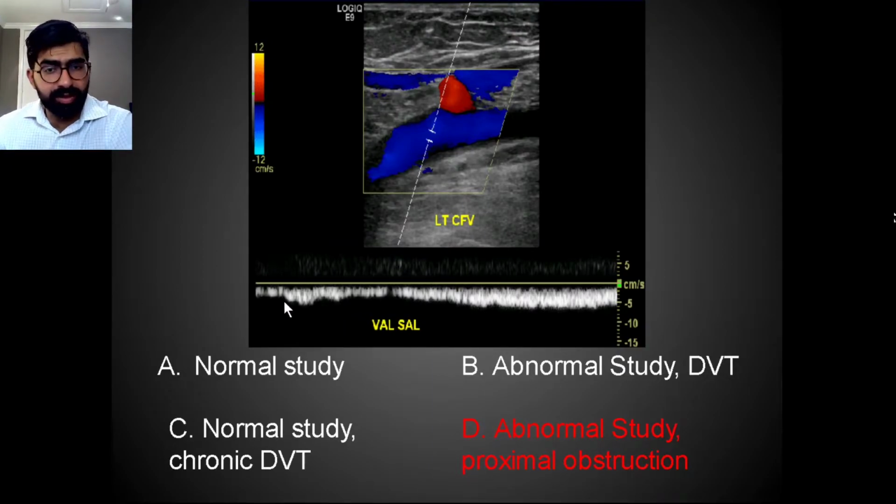Now notice it's all continuous flow towards the heart. So ask yourself why that is. Well, if you do have obstruction proximally, you're always going to need the entire cardiac cycle to bring blood flow back to the heart through collaterals. So we're just going to throw out random variables. Let's say that you get a liter down in the leg a minute.